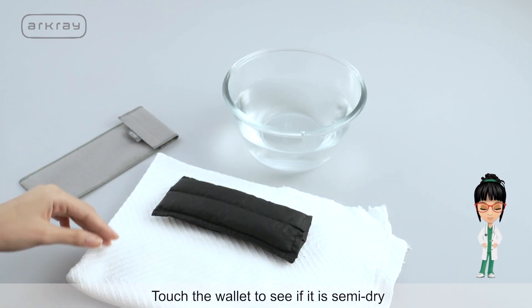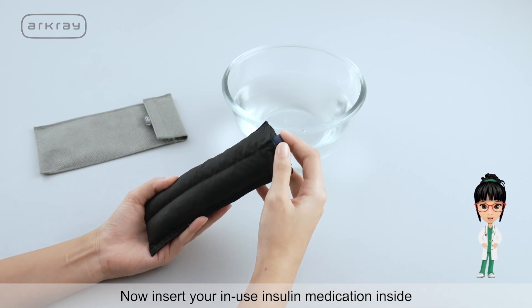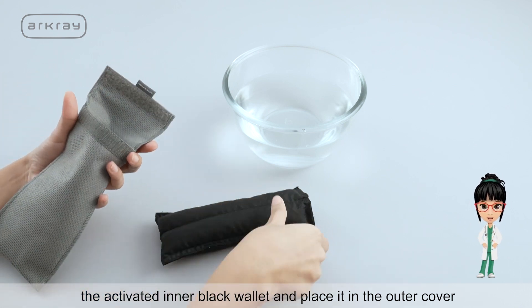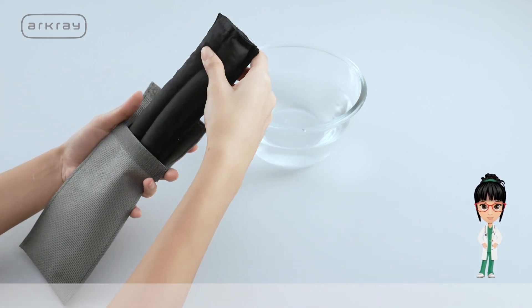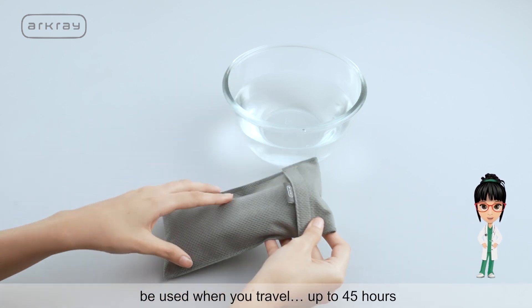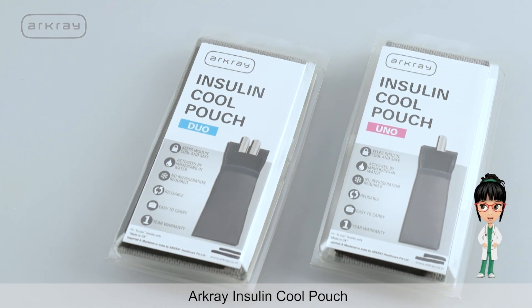Touch the wallet to see if it is semi-dry. Now insert your in-use insulin medication inside the activated inner black wallet and place it in the outer cover. Your in-use insulin is now safe and ready to be used when you travel — up to 45 hours. Arkray Insulin Cool Pouch.